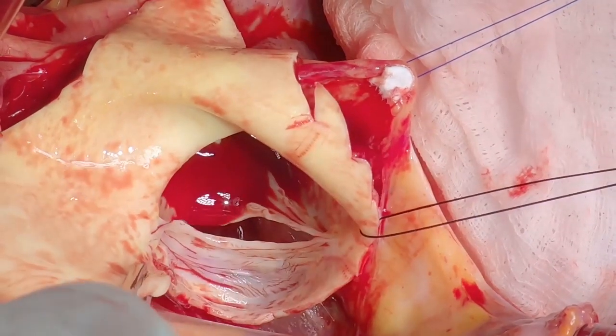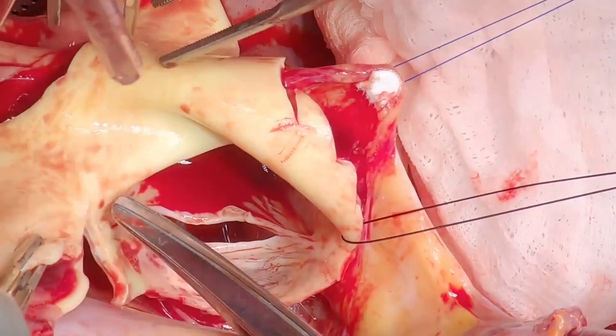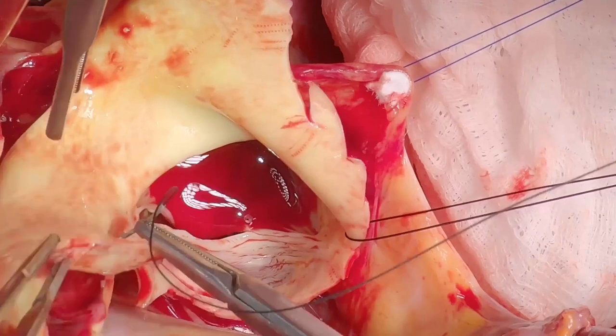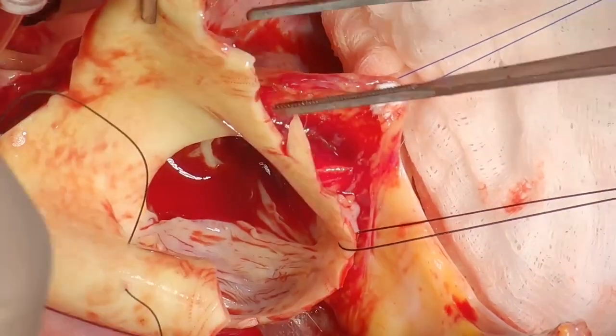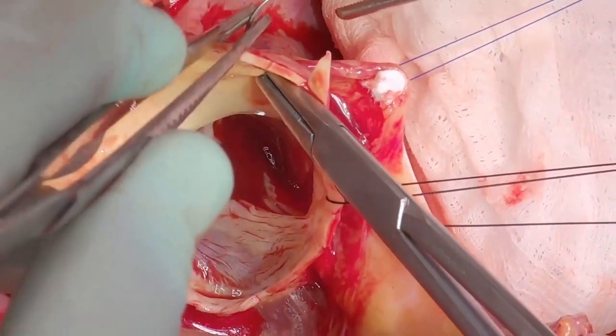The principle is always to make the bicuspid valve symmetrical, so tension sutures to maintain tension on the commissure are important. Some silk sutures are being used to put tension on those commissures.